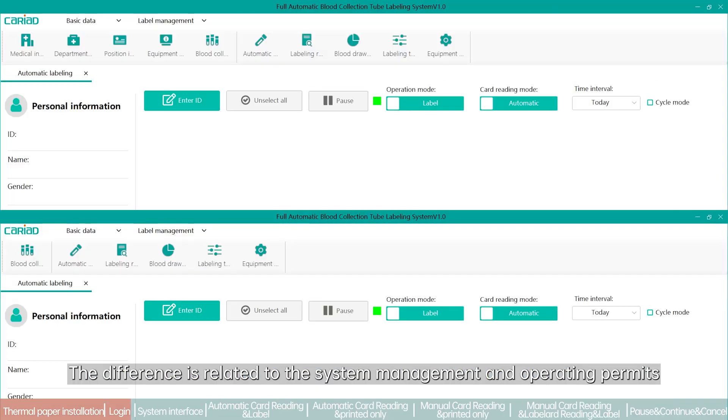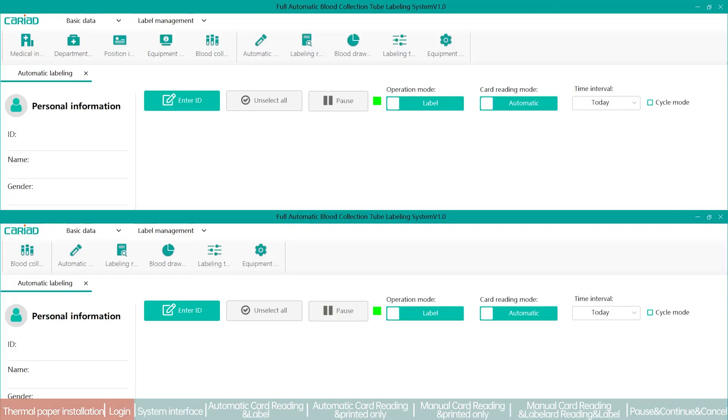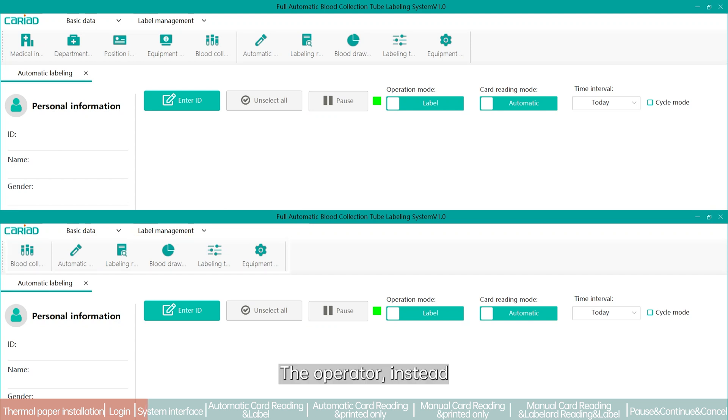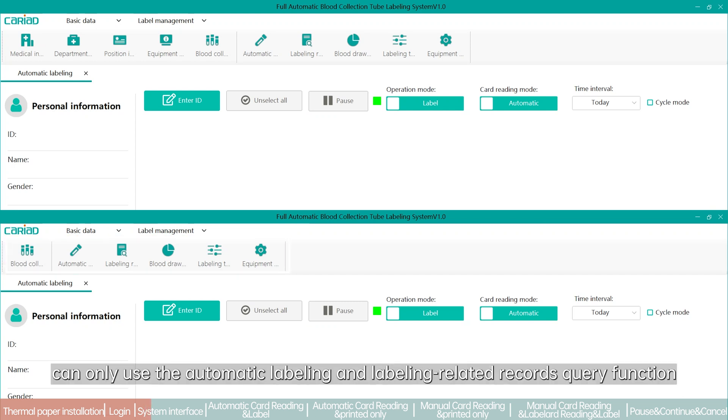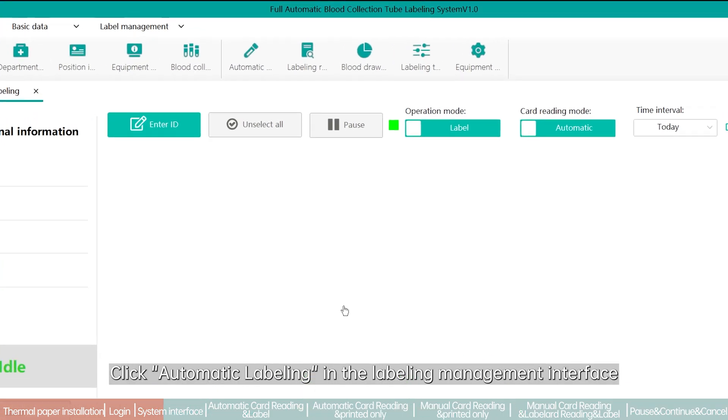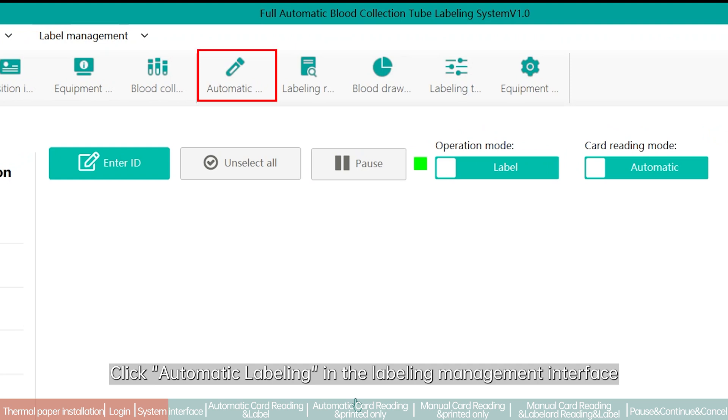The difference between user types relates to system management and operating permissions. The system administrator has the highest access level and can troubleshoot and change all parameters of the system. The operator can only use the automatic labeling and labeling-related records query function.